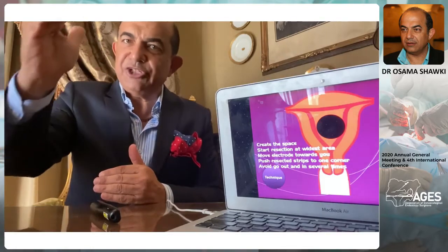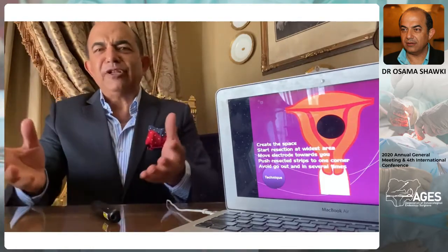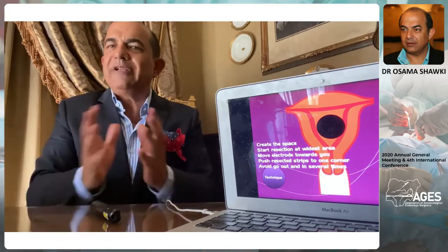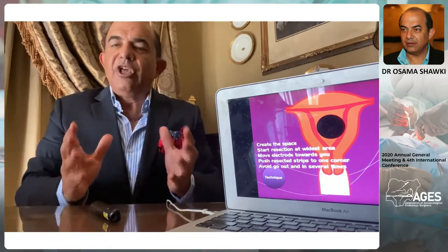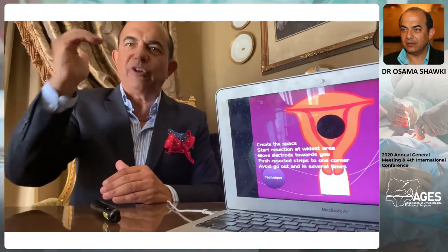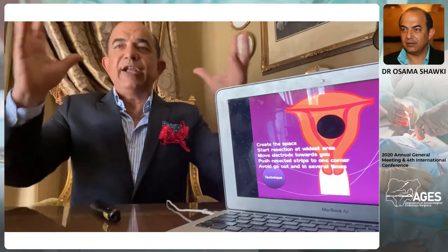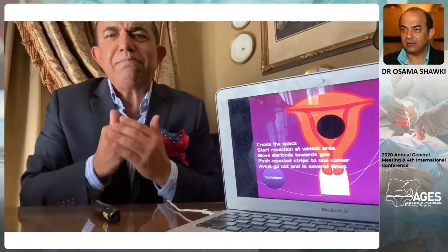Again, intrauterine surgery is not hysteroscopy, okay? And it's not that 80% of the work is simple, but for the large myoma, it's an intrauterine surgery. You have to achieve a high pressure to see well, and then you start to cut into the myoma or in the septum. If you see well, and visibility is okay, and equipment is well, you should finish maximum in 15 minutes.